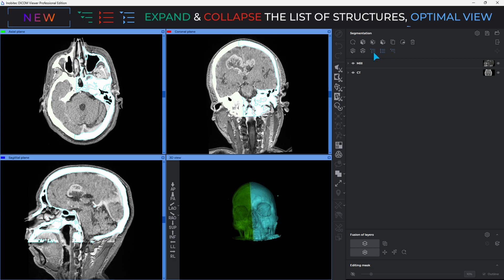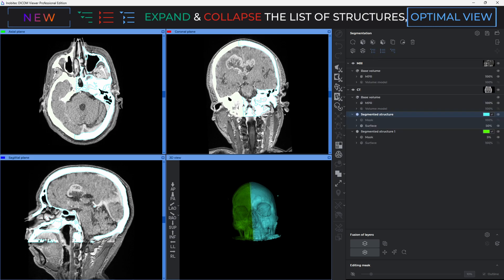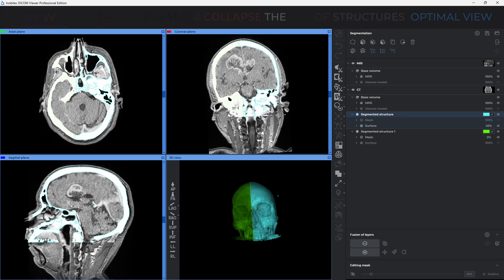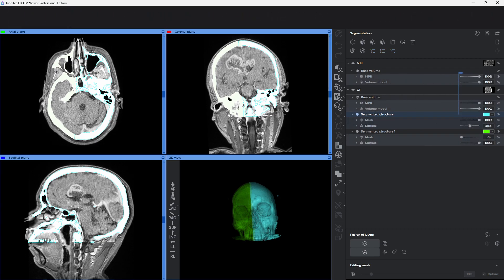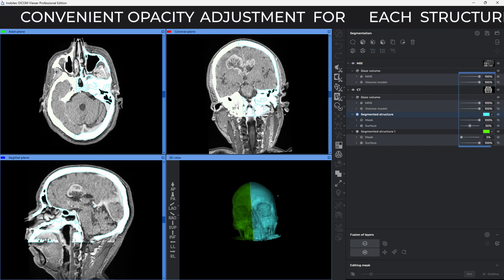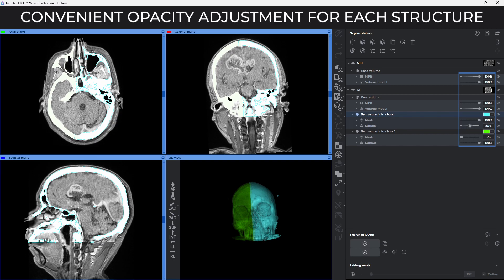If you are working with large numbers of structures, the Optimal View button allows you to compact all elements of the list. It has become easier to adjust the transparency of each structure and mask with the slider, which becomes visible on mouse hover.